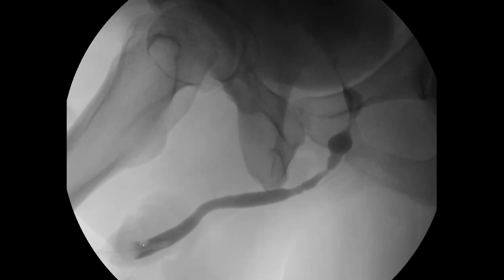So just to review for our residents and audience, I put a 10 French Foley catheter into the tip of the penis, and I blew up the balloon in the fossa navicularis to get some tension, and also put a gauze around the tip of the penis to pull it, so I can lay it out so I could see the length of the stricture. We have this normal smooth penile urethra, and then we're going into the bulbar urethra. And here you can see that there's multifocal strictures and narrowing.